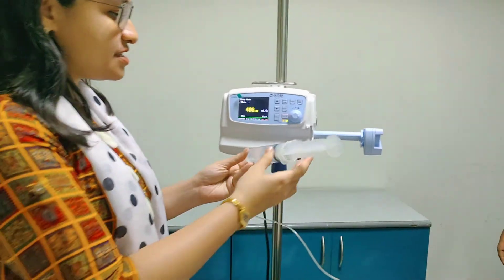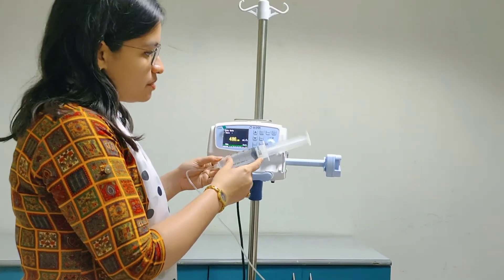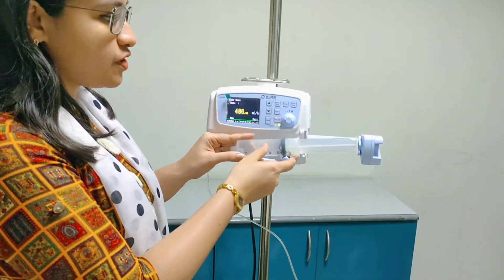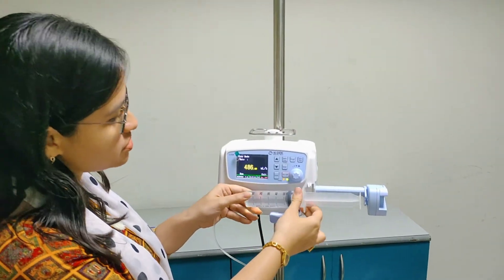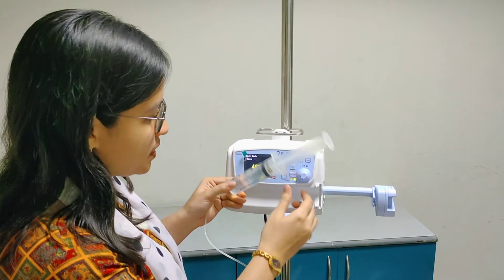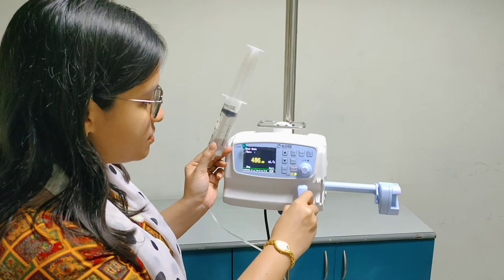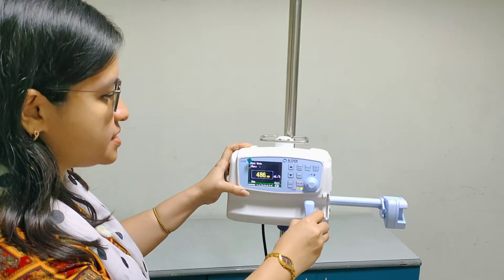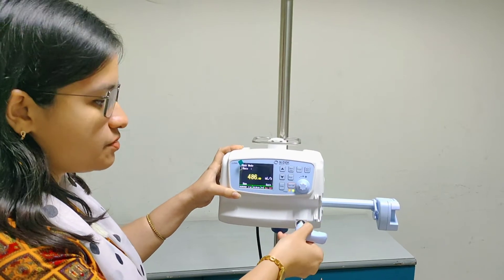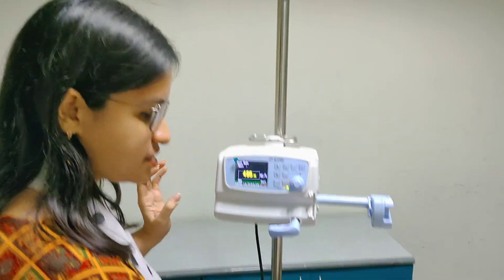Now we will insert the syringe. I have taken here a 50 ml syringe, but you can use syringe volumes from 5 ml to 50 ml, and any brand of syringe is compatible with our syringe pump. This is the syringe holder — it can move either way, this way or this way. Now I will fit in the syringe.